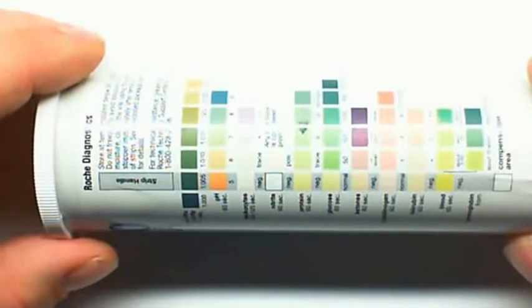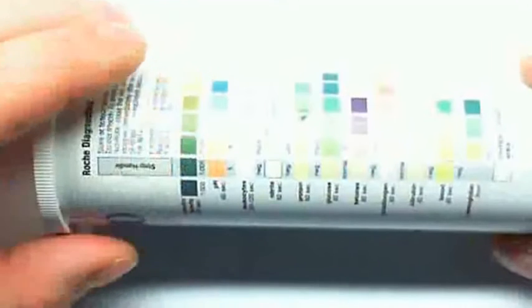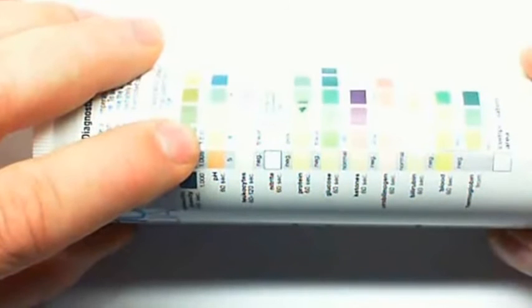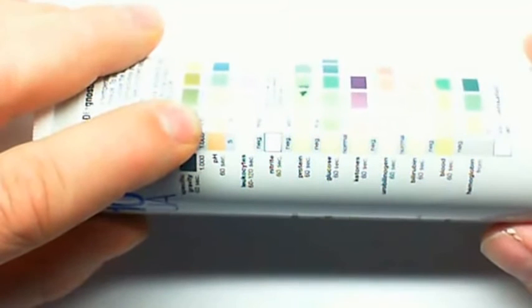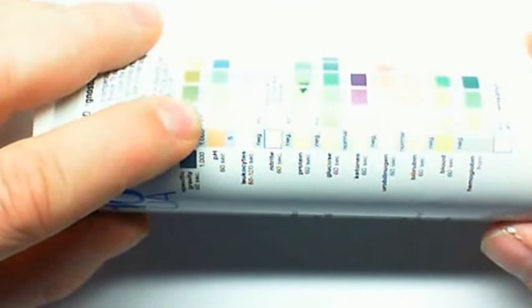The next strip is pH, and that's just a measure of the acidity of the urine. Normally urine has a pH of around 5 to 6, but it might vary normally between 5 and 8. One of the biggest things that alters pH is diet. So as a diagnostic, pH is not real strong unless it is consistently high or consistently low. A cause of high pH may be things like kidney failure, where bicarbonate is not absorbed or hydrogen cannot be secreted into the urine.